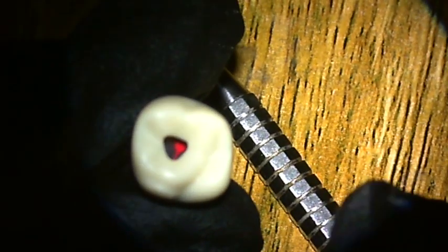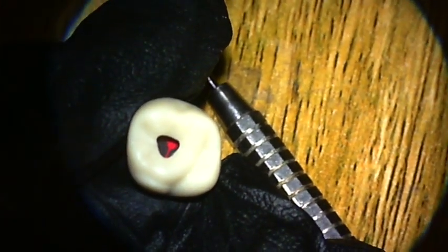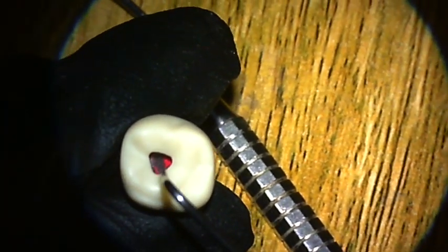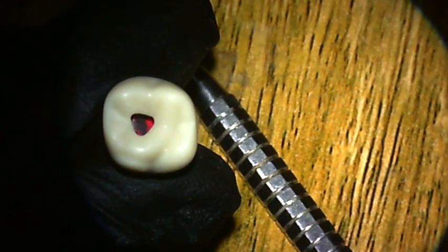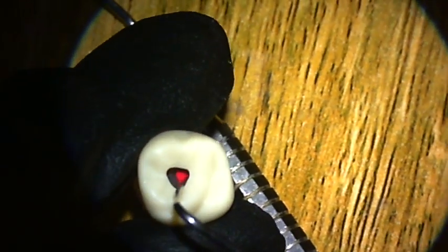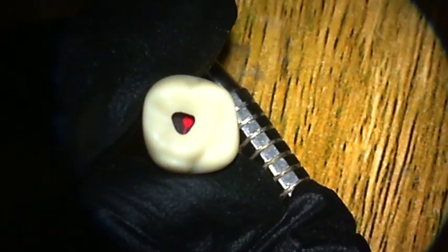If you injure the floor as well, by a minor injury, I mean like without depth, that is okay, it's satisfactory. But if you injure it big time, a gross indentation in the floor, that's not okay. And please note that in the exam the floor is white, not translucent, so they will be able to see those injuries better than we can see them here on those translucent floors.